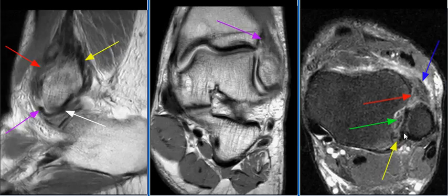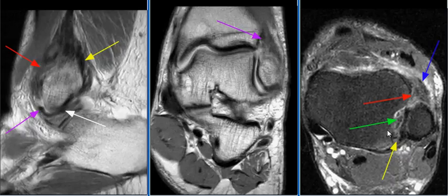The posterior syndesmotic ligament also demonstrates scarring, as seen on this image with the yellow arrow. There is synovitis in the central syndesmosis, as seen on this image with the green arrow.